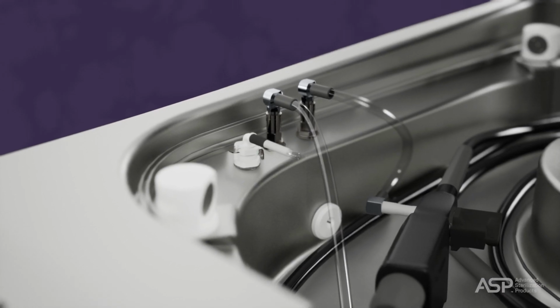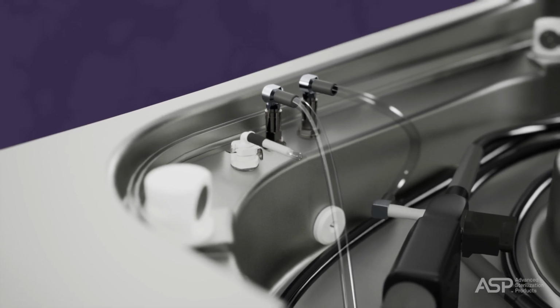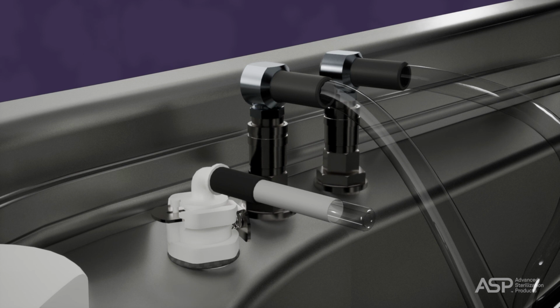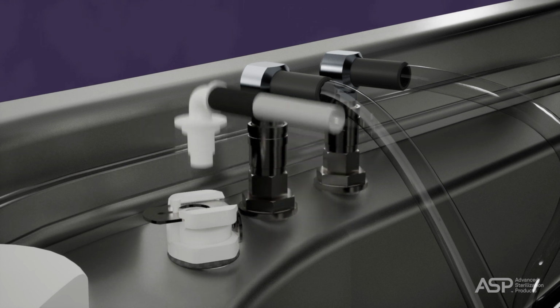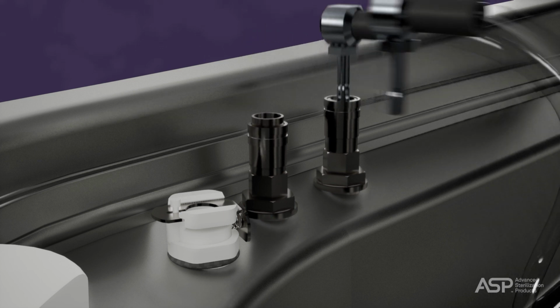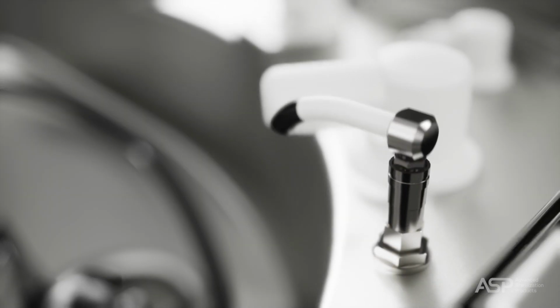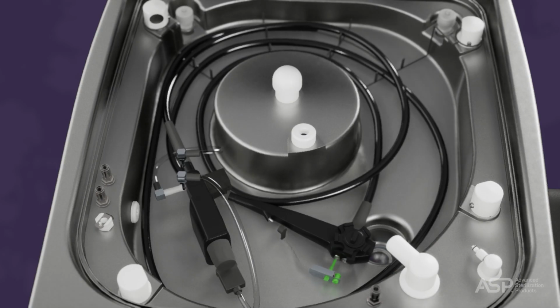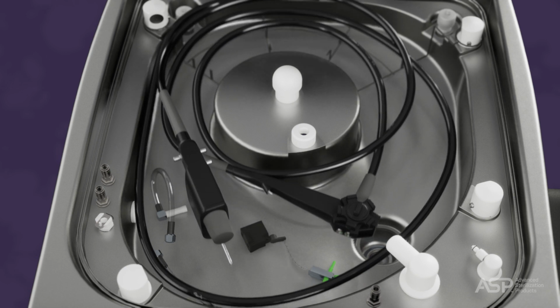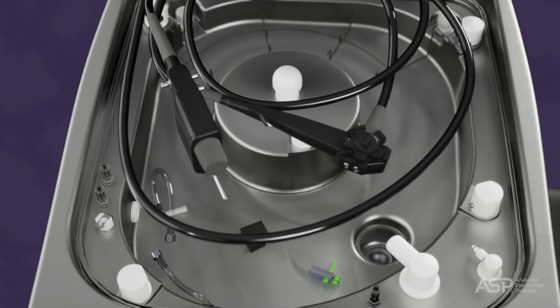Once you determine reprocessing was successful, using clean gloves, disconnect the tube connector to the elevator/water jet channel by pushing the release button. Then disconnect all other connected tubes by lifting up the ring at the base of the connection fitting. Next, disconnect and remove all connectors from the endoscope. Finally, remove the endoscope carefully from the basin and follow your facility policy for drying and storage.